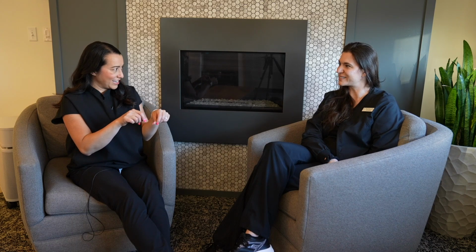So it depends on the machine that you buy. The ones we have, with the huge range of concentrations, are a more expensive machine, and it has more dials. The at-home machine is usually just one dial or an on-off. If you have the on-off, it's probably just going to be for water, where you bubble the ozone through the water and make it ozonated. You can use that for cleaning, laundry, vegetables, skin, all of those things.